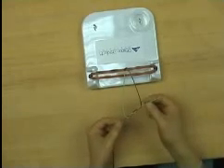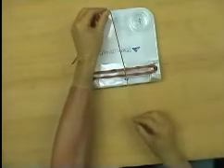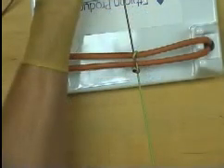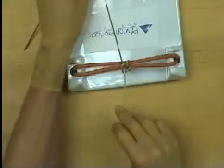The first throw is snugged down, with the left thread moving away from the body so that the knot is square. The surgeon's knot is then completed as previously described.